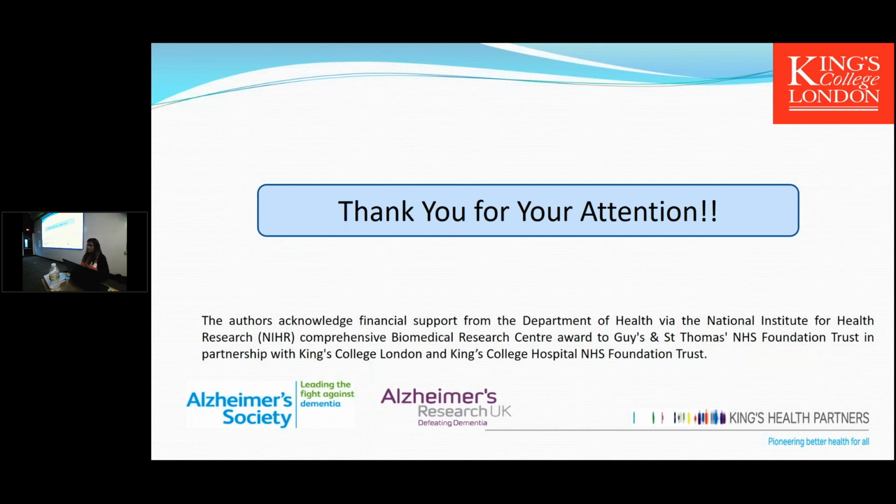But of course, there's nothing that would preclude you trying to do very specific ROI areas and then interrogating that using the texture analysis. And as you may know, there are more interesting or complicated ways of doing texture analysis, so not just looking at one voxel, but the relationship of one voxel to another voxel, their proximity and their similarity, the frequency of intensity between two voxels, also the angle at which the other voxels are relative to the voxel you're interested in, and also there are other ways to interrogate the data to look at run lengths of voxels.